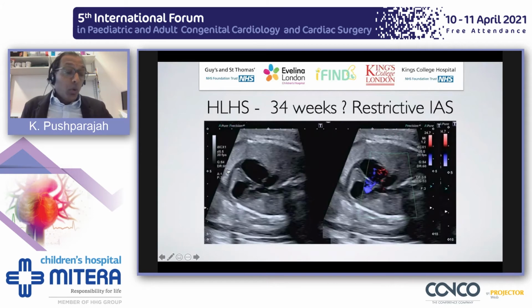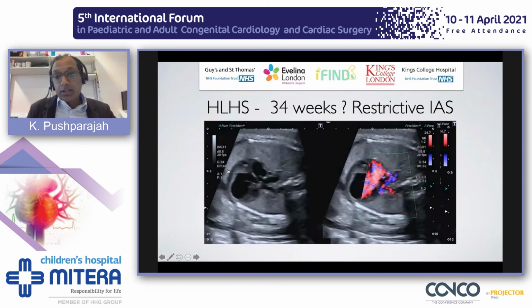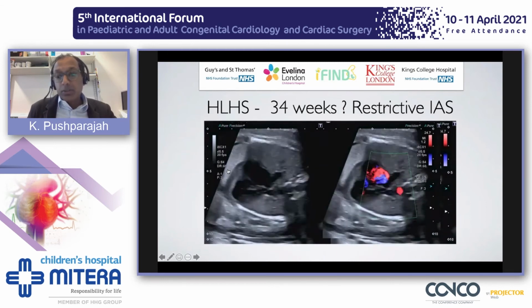All of what we do is multimodality. The MRI augments what we do with ultrasound. And this fetus from Dr. Vigneswaran, my colleague, was a concern for a really restrictive atrial septum on ultrasound.